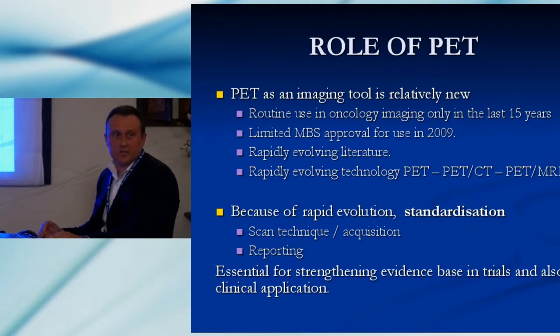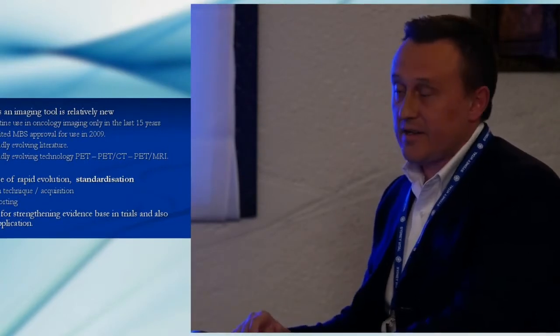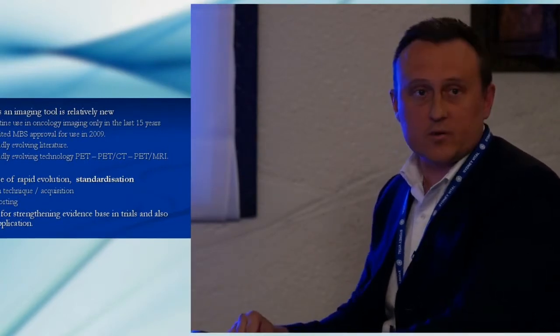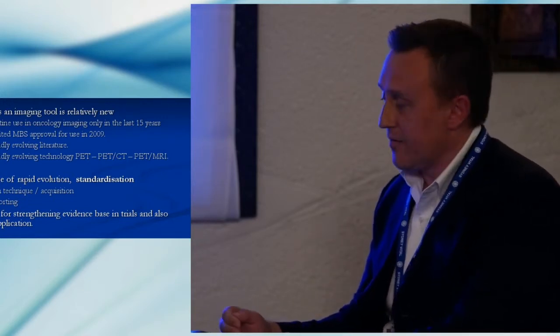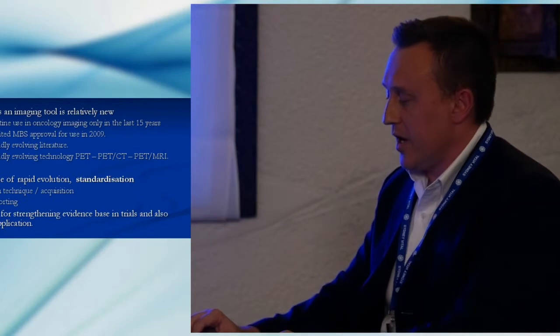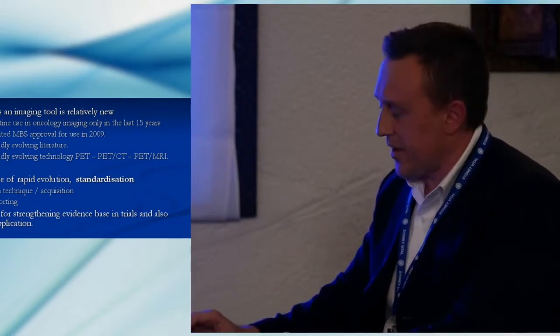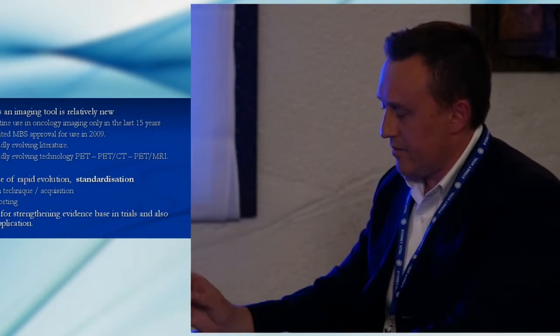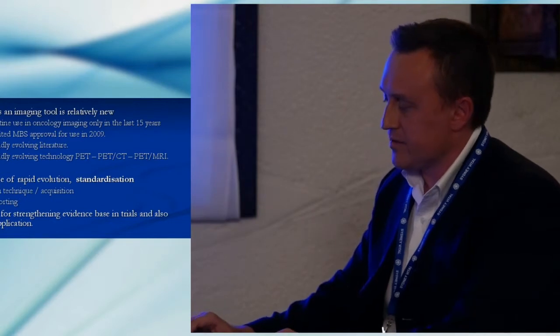So we've gone from PET to PET-CT to PET-MR in the space of just over a decade. Because of this rapid evolution, I think standardisation of the way we acquire our scans and also the way we report our scans is really important. And it's essential for strengthening the evidence base we have in future trials and also in the way we practice our trade and make sure that the way we report our scans in clinics is useful.